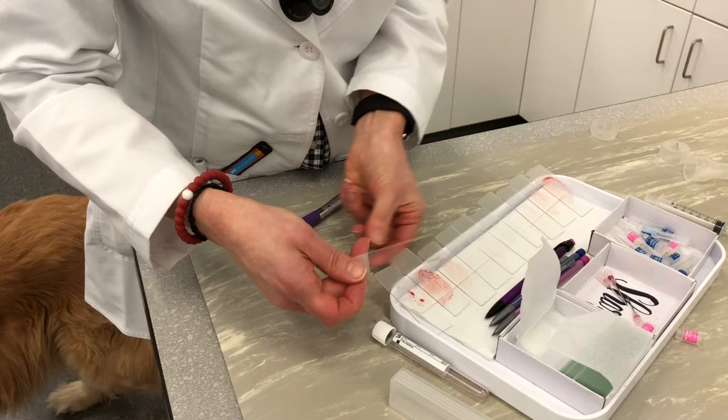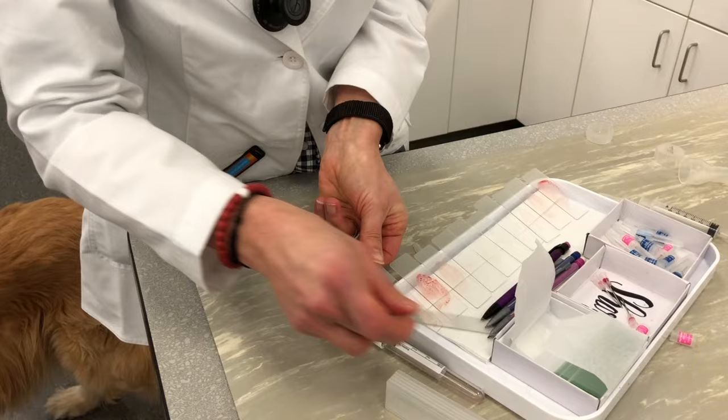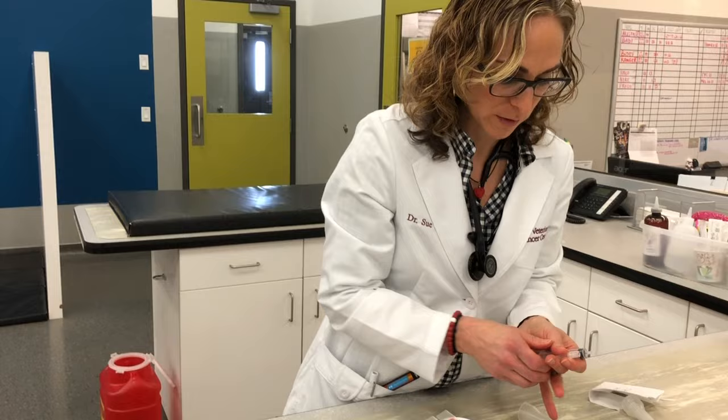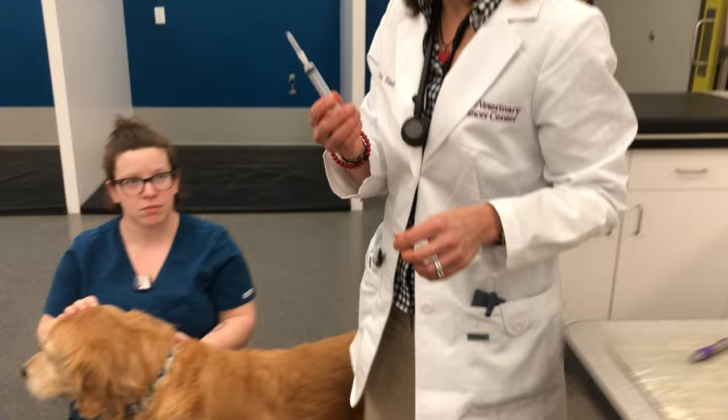That's a bad smear. Now we are going to do an aspirate of his lymph node for flow cytometry to help confirm that he has lymphoma and determine if he has B or T cell. That's when I use the needle with the syringe on.